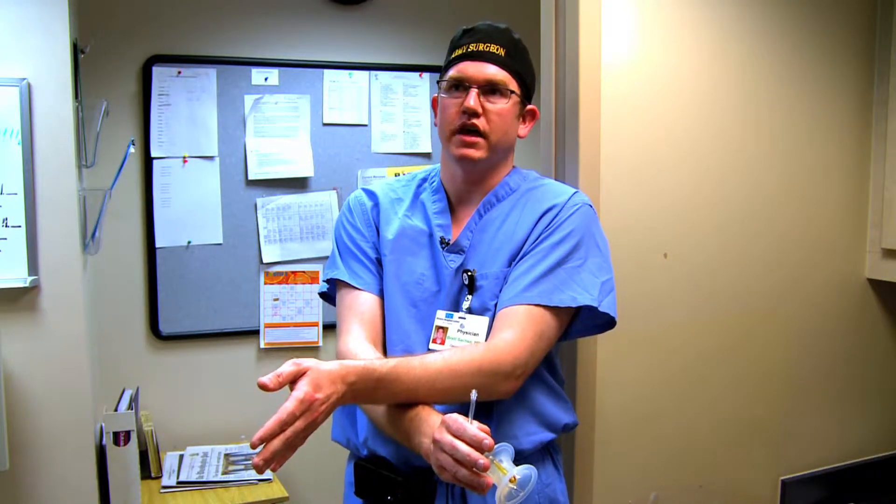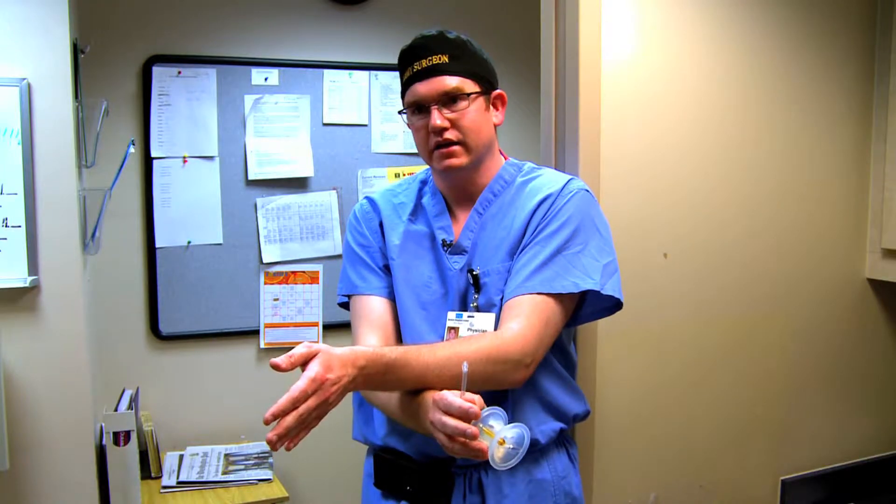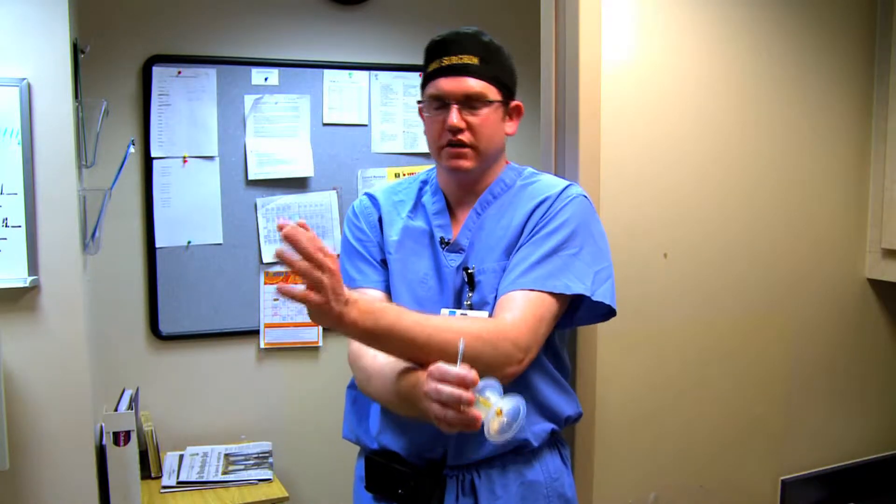One of the challenges initially with laparoscopic single-site surgery is that there was a lot of operator error. When you put the instruments in, your arms are automatically crisscrossed. So as the surgeon, when you're looking at the screen and you want to move the instrument on the left, you actually have to move your right hand — and if you want to move the right instrument, you have to move your left hand.